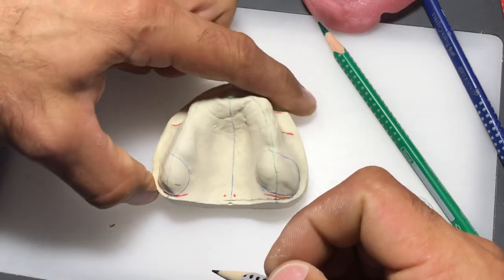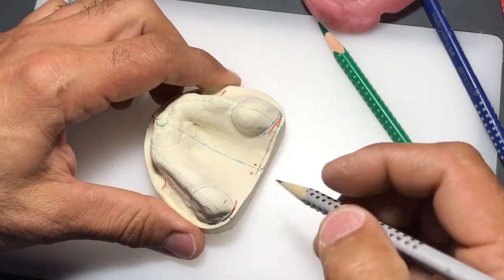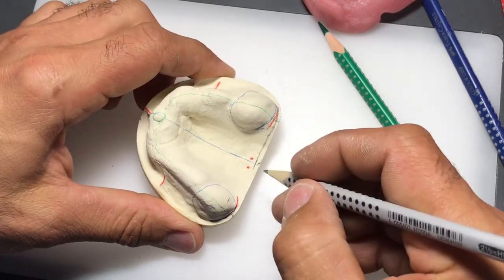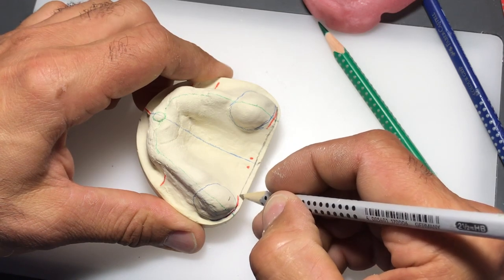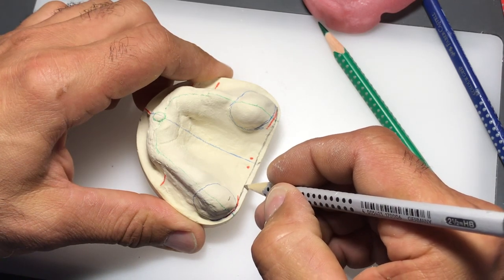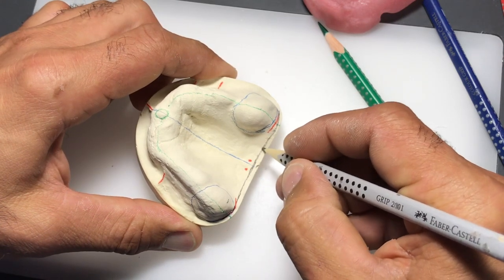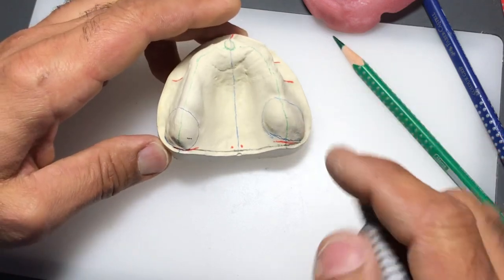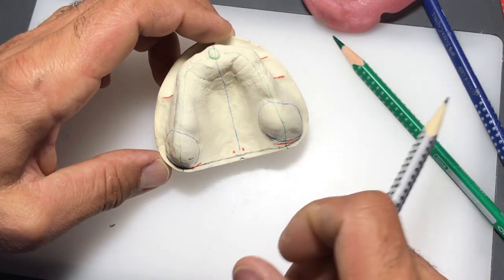You might have to rotate your model to get an ideal view, and I'll do the same thing on the other side. Notice this line is not really a straight line - it has a slight concavity towards the anterior portion of the model. If we turn the model to its side, this is the most challenging part of the outlining, because the closer we can get it to where we think the denture will finish, the easier it will be to perform the final impressions.